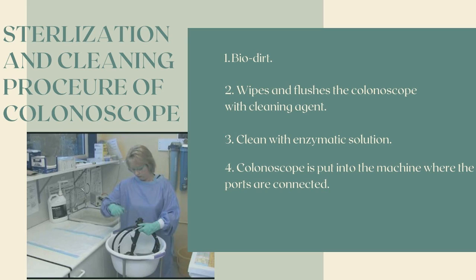Sterilization and cleaning procedure of colonoscopy. A study done over the last few years by Canadian researchers discovered that up to 15% of the scopes at some centers contain biodirt, which are cells and debris from prior exams. This biodirt can harbor harmful microorganisms. There are several phases of the cleaning process.